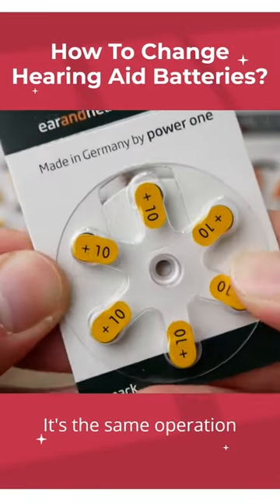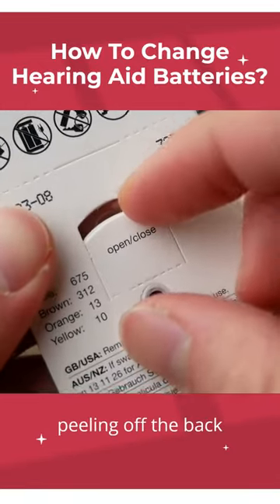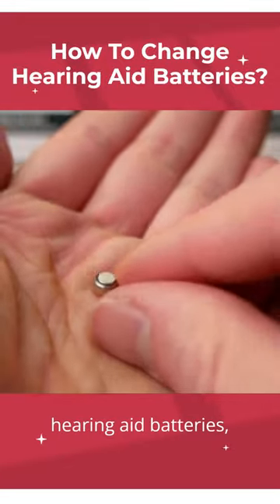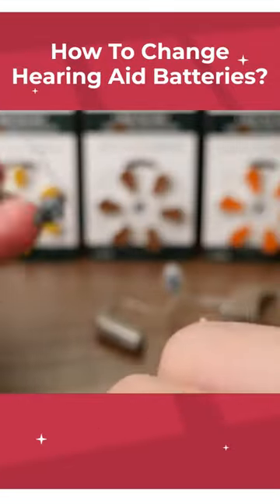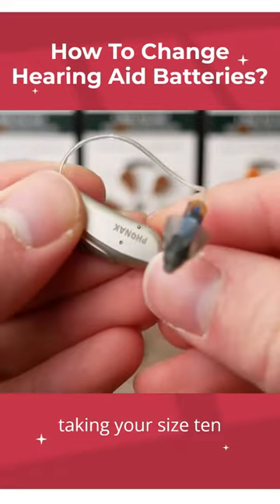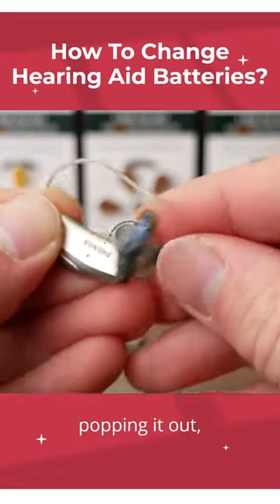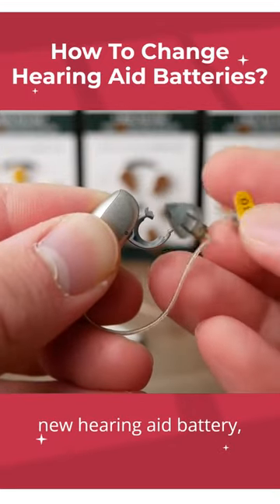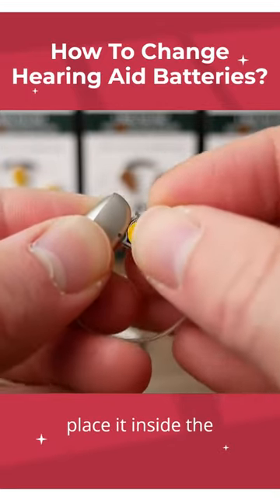For the size 10 battery, it's the same operation: peeling off the back door, popping out one of the hearing aid batteries, taking your size 10 battery hearing aid, popping it out, and you can take your new hearing aid battery and place it inside the compartment.